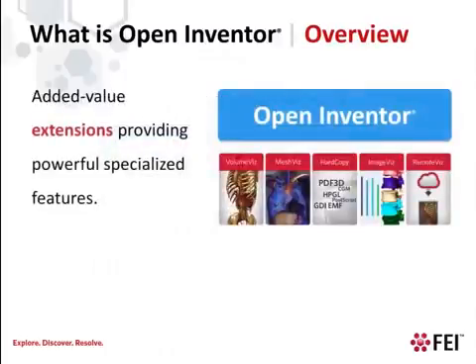In addition to the core feature set, we've also built extensions that add the additional features needed for specific kinds of data and for specific markets. They actually extend the set of objects, data types, and rendering techniques that are pre-built for you. Let's quickly take a look at what extensions provide for medical and life science applications.